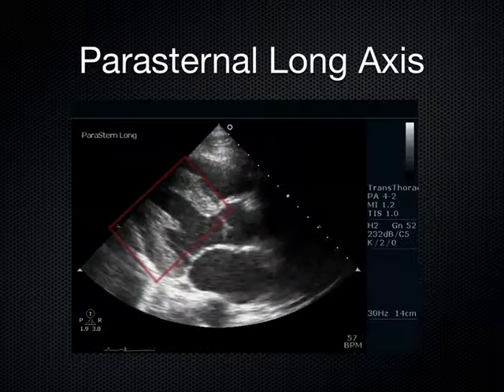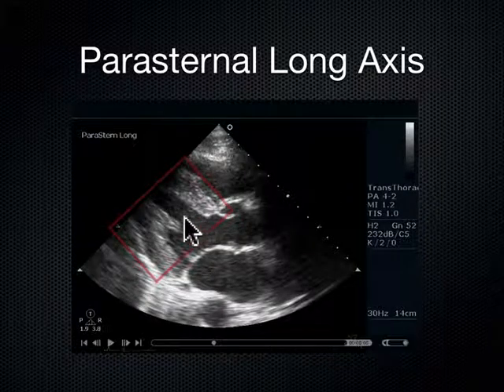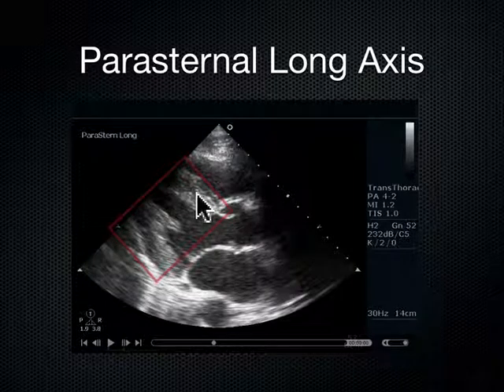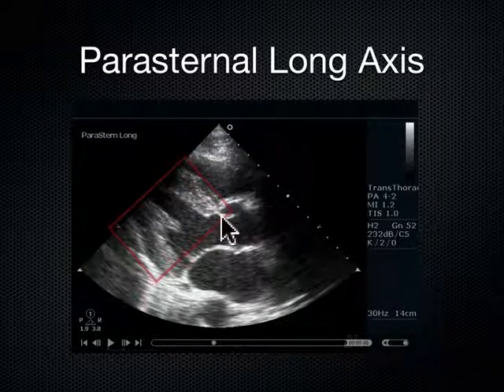Let's call this right here end systole. How do I know that is end systole? Well, the posterior wall and the interventricular septum are close to each other right there, and this aortic outflow tract, that's open. This is the one leaflet of this aortic valve. It's a tricuspid valve. We don't see all the leaflets here. There's one leaflet. We can see it's clearly open, and I'm sort of hallucinating a little bit.